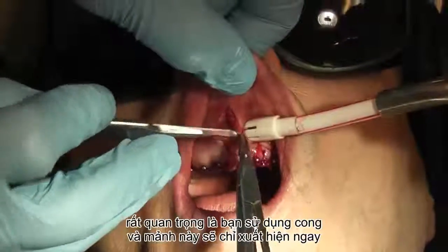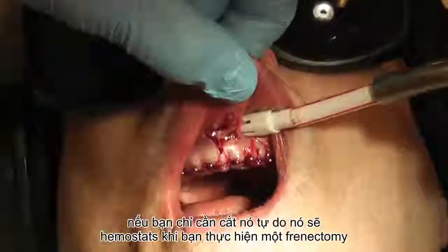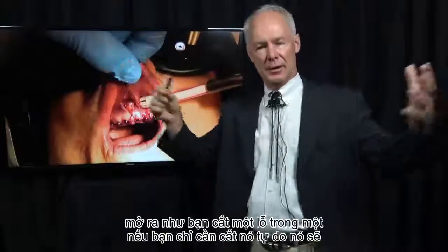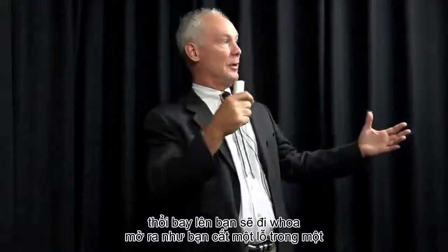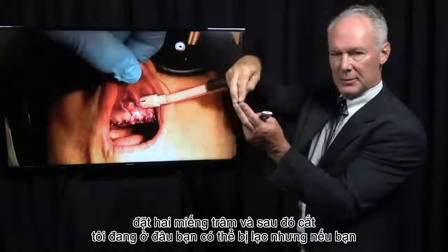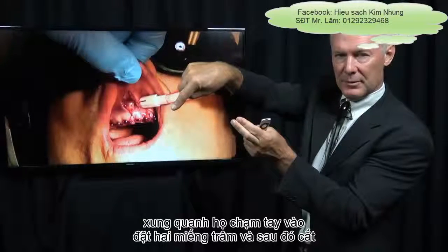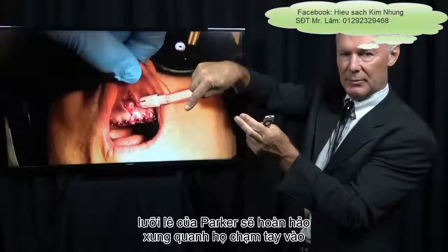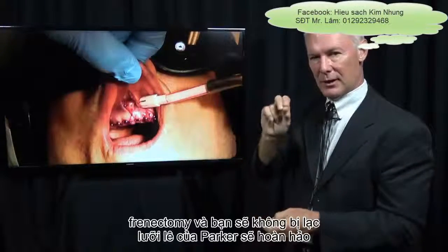It's very important that you use curved hemostats when you perform a frenectomy. If you just cut it freehand, it's going to open up like you'd cut a hole in a blown-up balloon — you can get lost. If you place the two hemostats and then cut around them, touching the hemostat with the Bard-Parker blade, it'll be a perfect frenectomy, and you won't get lost.